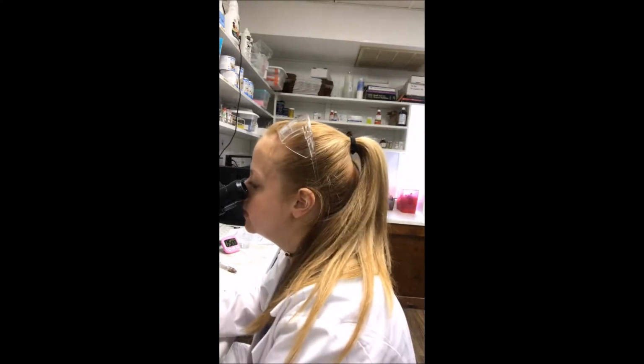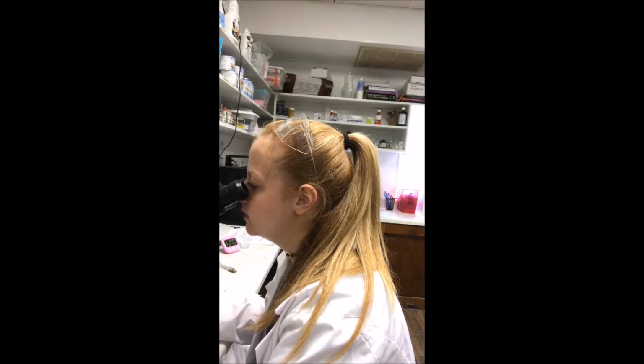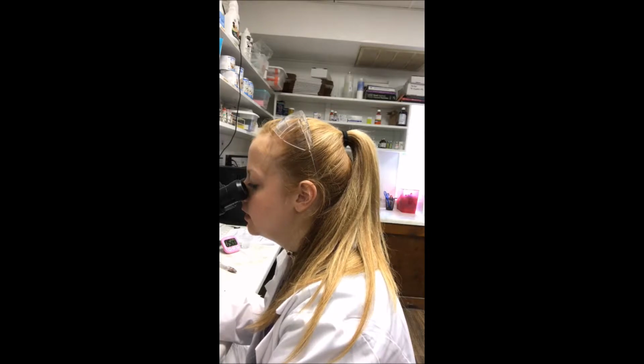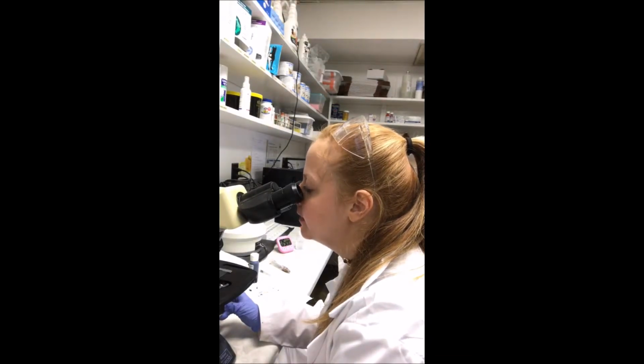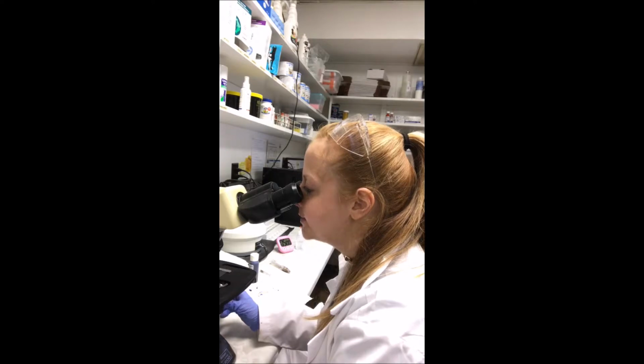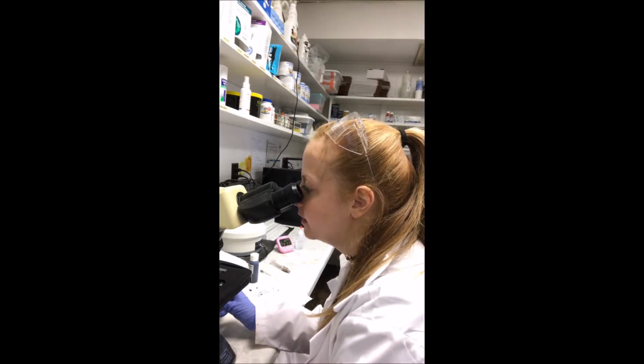The dog that I'm doing this on is a Pound Dog. So she's a stray, and I live in the state of Alabama, so here in the South we see a lot of heartworms. So there's actually a very good chance that I will see some heartworms. Okay, I actually am seeing some Dipetalonema. I'll describe the difference between that and the microfilaria, the Dirofilaria, I'm sorry, here in just a moment.